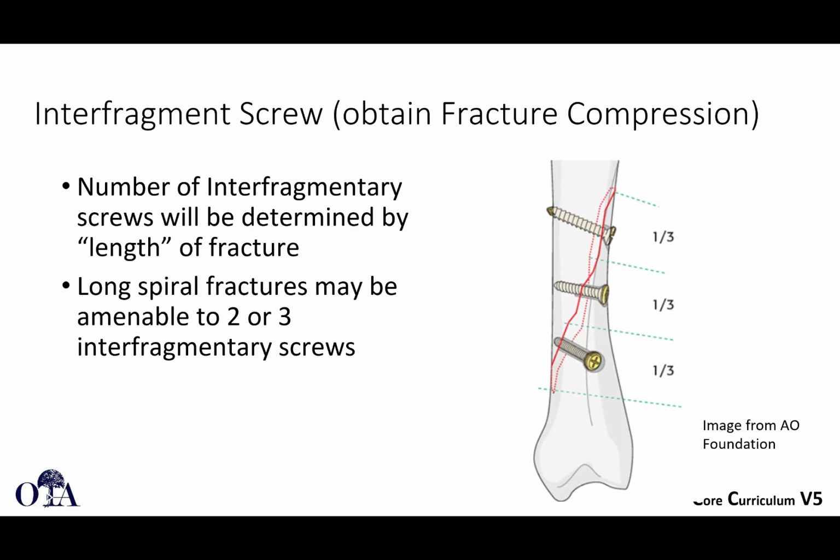How many lag screws you place could depend on the length of the fracture. If you have a very long spiral fracture, you can sometimes place multiple interfragmentary screws as shown here.